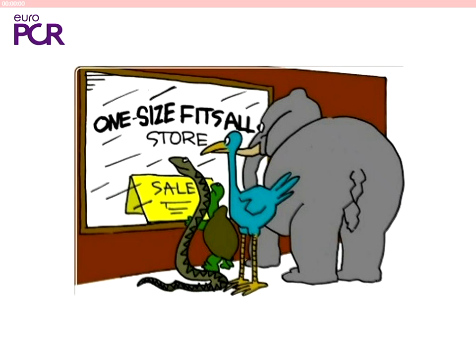And stopping. Do you think that if you hadn't done culotte, simply as you suggested, your option, a covered stent sacrificing the side branch, it would have changed anything in retrospect? Really, if he stopped antiplatelet therapy, it will be the same issue, the same outcome. So, maintaining. Yeah, of course. Good. Any other?